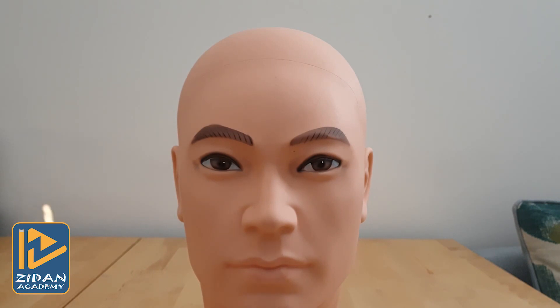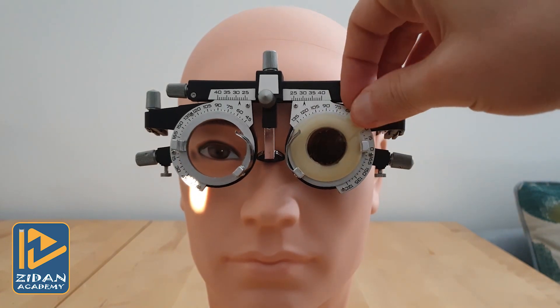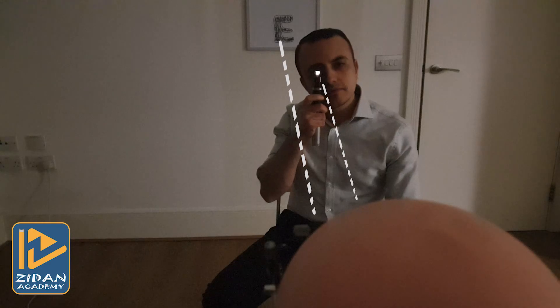You need to follow these steps to obtain relaxed accommodation. First, if you are performing refraction on one eye, you should not put an occluder in front of the other eye. Then ask your patient to fixate on an unaccommodative distant target with the eye not being refracted. I prefer to use a small round light as a fixation target, as projector letters can still stimulate accommodation — even the bigger ones — but you can still use a large letter if you don't have a small light source.